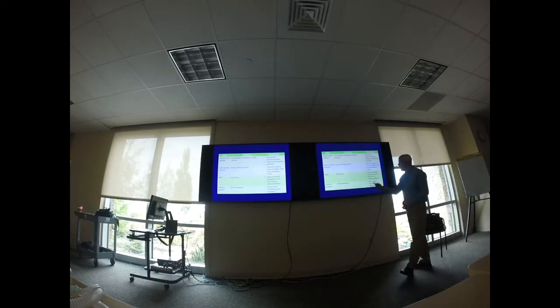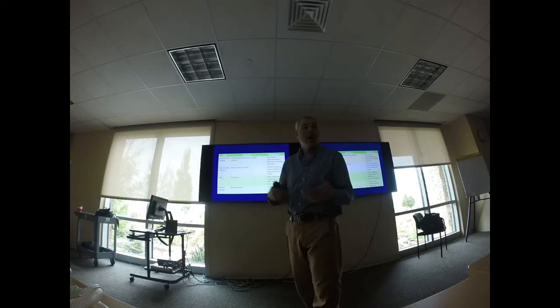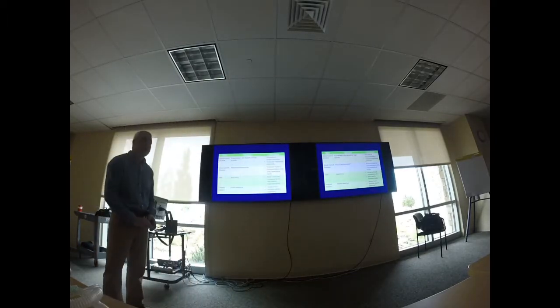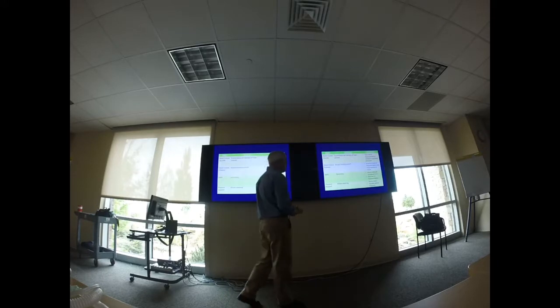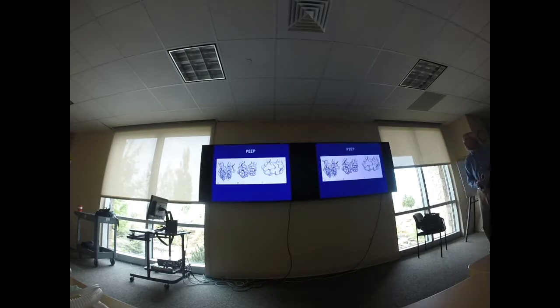Synchronized intermittent mechanical ventilation is great because it allows synchrony, but it also possibly causes some increased workload for the patient, right? Because they're having to take their own ventilatory effort, and when they do, they don't get what you have plugged into it, especially if you didn't give any pressure support. So it could lead to some hypoventilation. Pressure support allows weaning, and there's some variable patient tolerance associated with it.